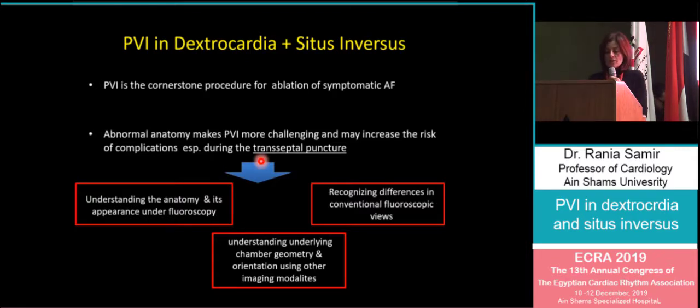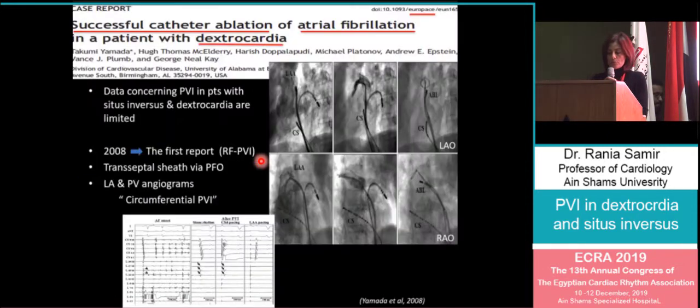Also, you have to recognize the difference in conventional fluoroscopic views. Since the heart is flipped to the right side, your conventional fluoroscopic views are also reversed. So your RAO becomes your LAO, and your LAO becomes your RAO, and you have to know this before the procedure.